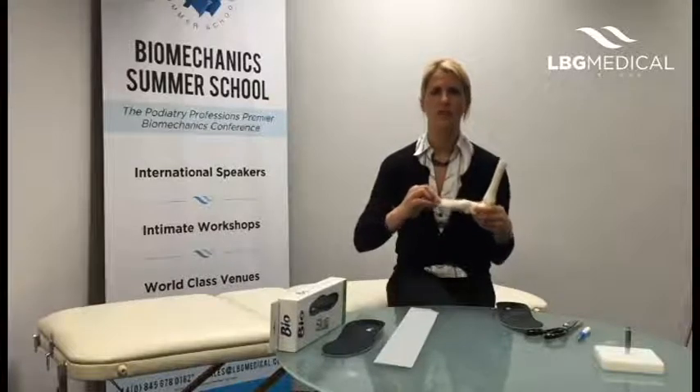The idea of using a distal hallux wedge or a cluffy wedge is that we wedge right underneath the first metatarsal, underneath the hallux, and the idea is to post it so we're pre-loading that joint if you've got a patient with a functional hallux limitus.